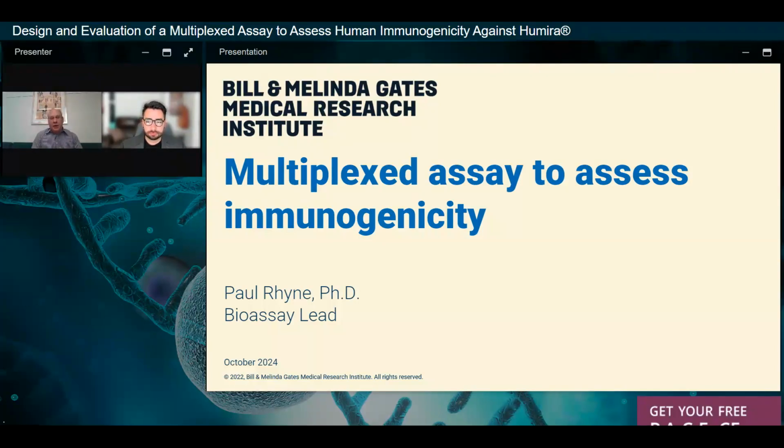We essentially did that for this strategy because we had to purify the antibodies using an acidification step first, where we would acidify the sample and then put it in a mixture with biotinylated Humira, which was captured on those streptavidin plates, and that would have gotten rid of most of your drug if there was any on there.